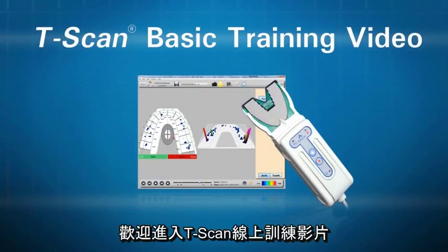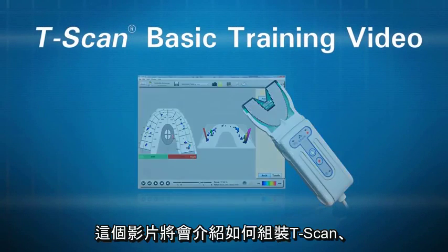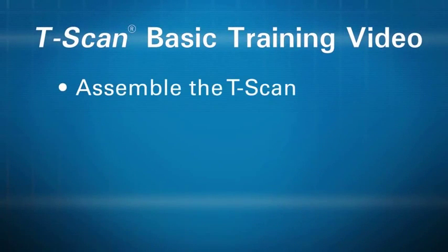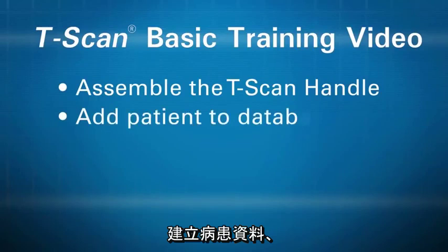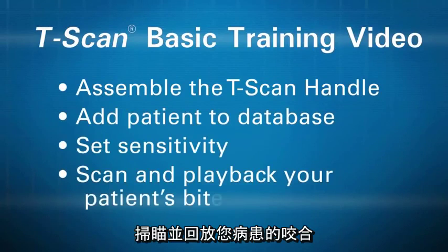Welcome to the T-Scan training video. This instructional video will show you how to assemble the T-Scan handle, add a patient to the database, set the sensitivity, and scan and playback your patient's bite.